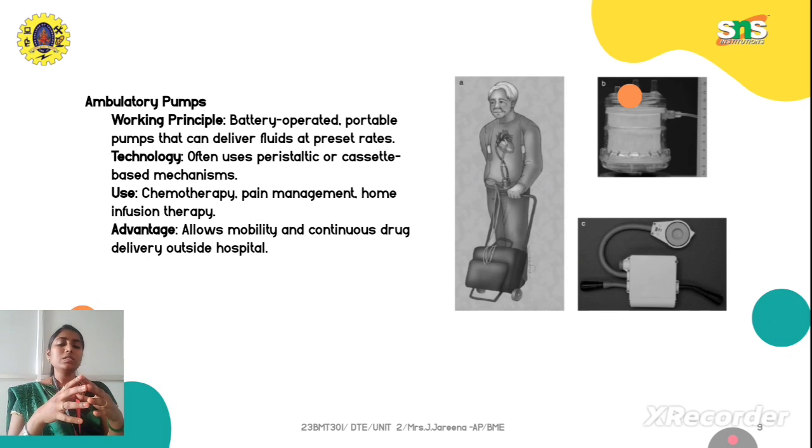Yes, with this we will complete. We have completed the different types of infusion pump, that is, one based on gravity and another based on positive displacement. In the next class, we will see the block diagram of this infusion pump.